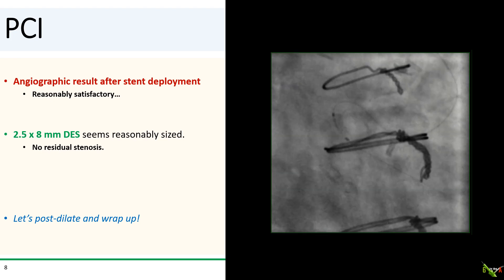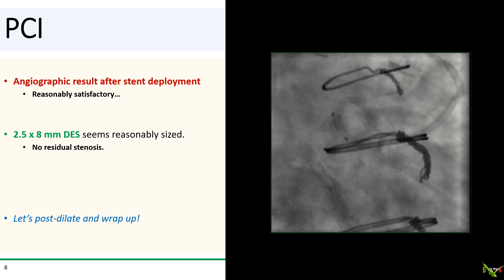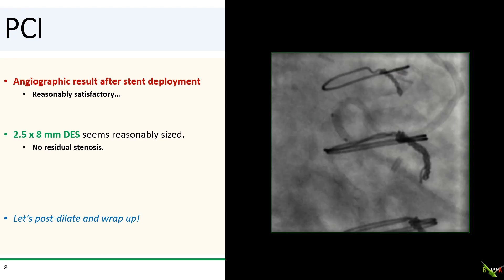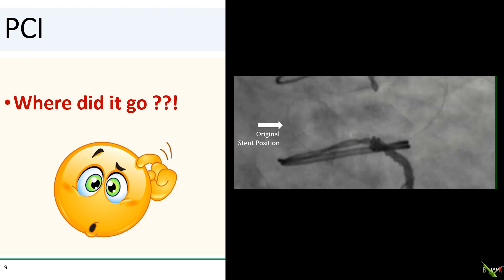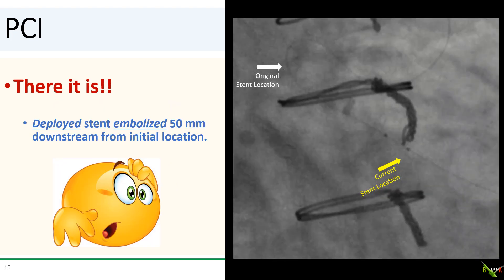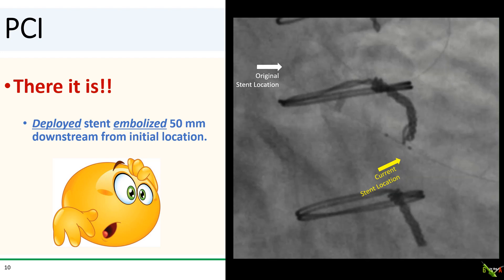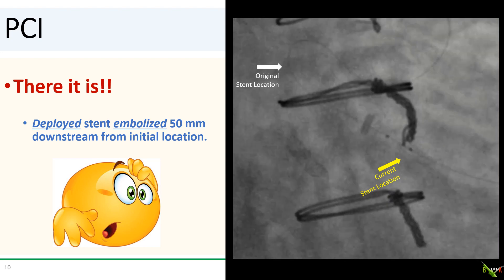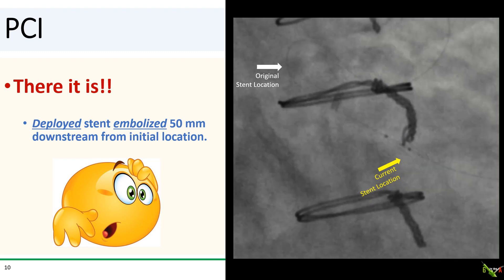The stent looked well-sized and there was no residual stenosis, so you breathe a sigh of relief. All that's left is to post-dilate and wrap up. You reach for a 2.5 millimeter NC balloon for post-dilation and start advancing it. You press on fluoro to look for your stent — and wait a minute, where did it go? It's not there. You look a little further down the LIMA and, to your astonishment, there's the stent downstream from where you just deployed it. The stent just embolized about five centimeters downstream from its initial location. Extremely unusual.